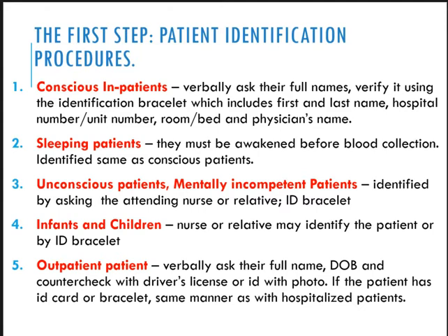Okay. So all you have to do is let the patient state his or her name verbally, guys, and his birthday. We can also use his or her ID bracelet. So guys, you have to make sure na you will not say their names. Okay? That's an incorrect way of identifying patients.